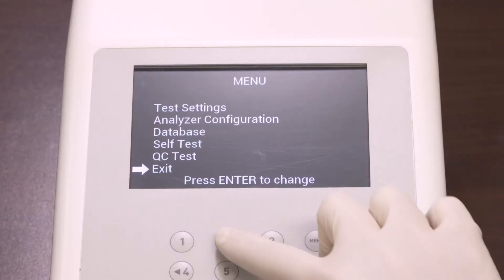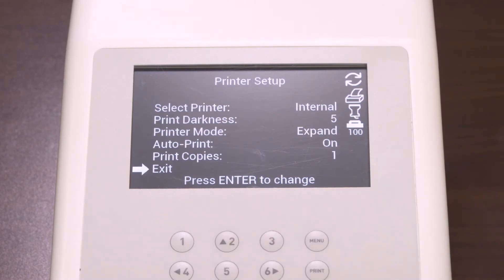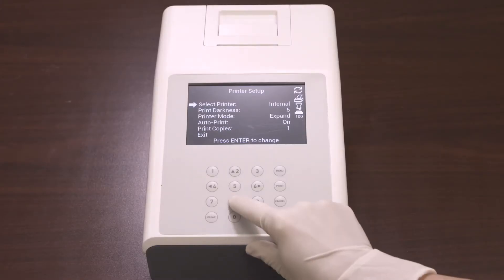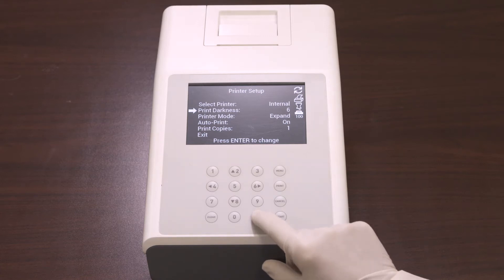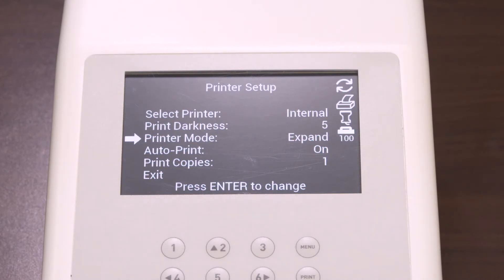You can configure your analyzer by selecting Analyzer configuration and pressing Enter. Select the printer setup to navigate through the printer properties. Choosing Internal in Select Printer prints the results on the internal printer; External prints the results on an external printer. Print darkness provides the level of darkness in the display, ranging from 1 to 9 — the darkest is 9 and the default is 5. For printer mode, selecting Normal prints the standard font size, while selecting Expand prints a larger font size. Selecting Autoprint On prints the results after each test and the printer icon is displayed; selecting Off requires pressing the Print key to print the results.